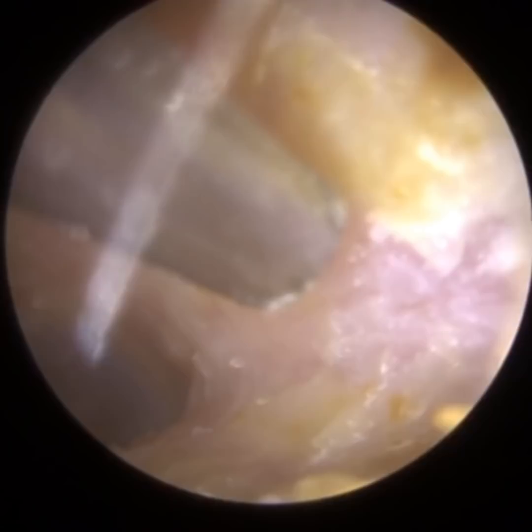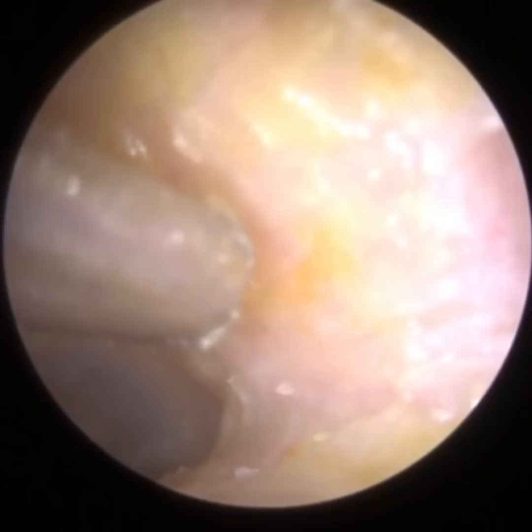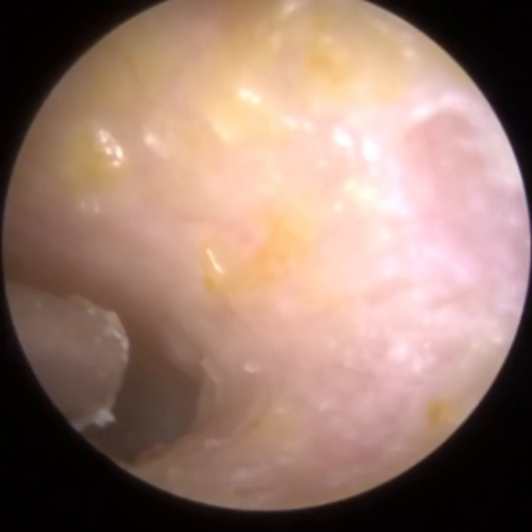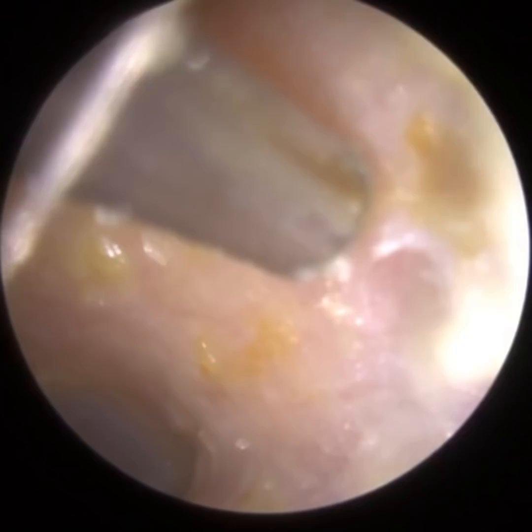Most typically I do remove the wax off the canal wall to detach it around the edge. Some parts of the ear, due to the anatomy, are difficult to gain access to, so we may peel off the wax or skin off some parts around the edge, but the remaining bit can be more complex.